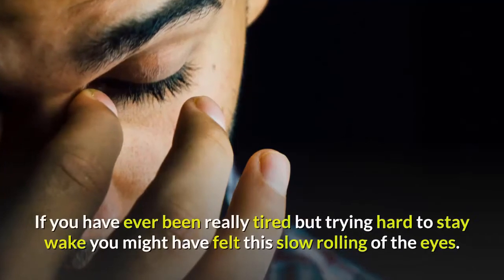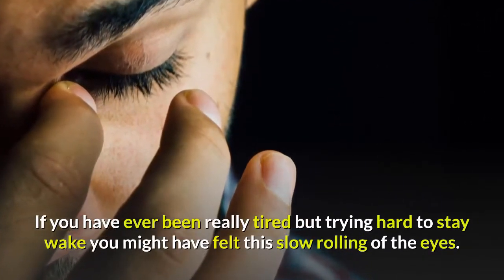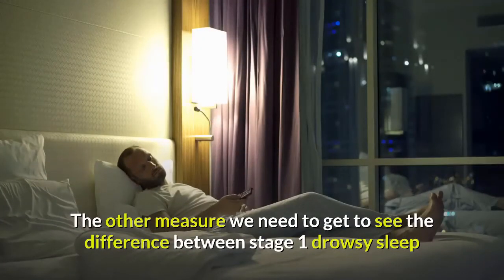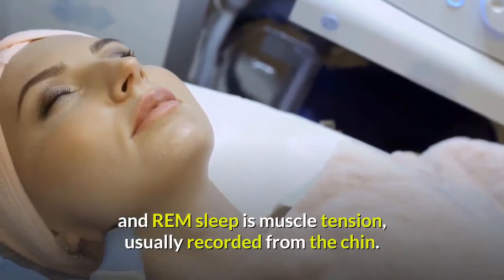If you have ever been really tired but trying hard to stay awake you might have felt this slow rolling of the eyes. The other measure we need to see the difference between Stage 1 drowsy sleep and REM sleep is muscle tension, usually recorded from the chin.